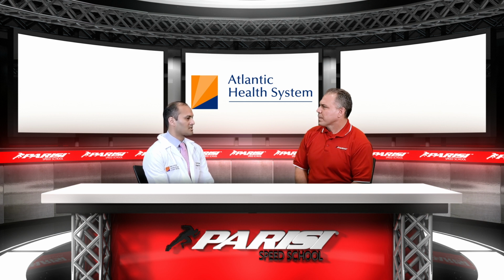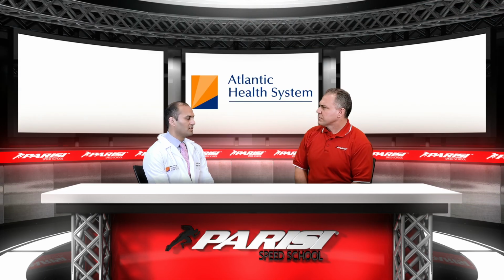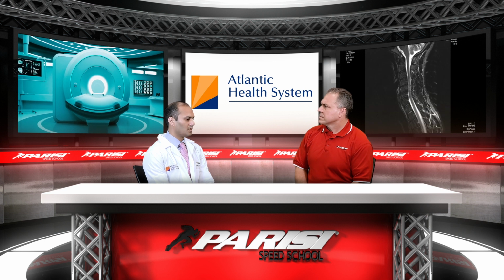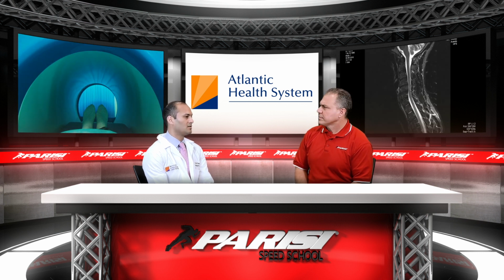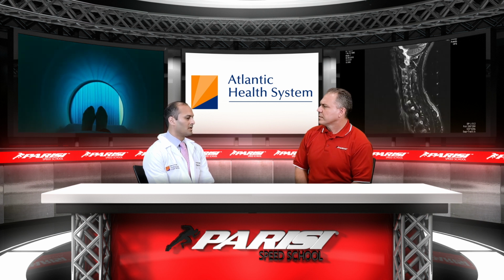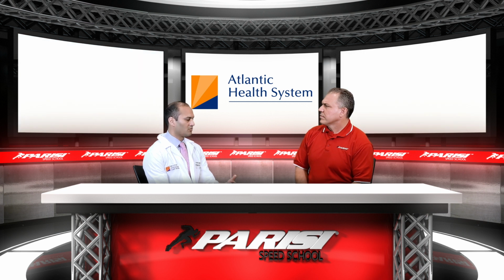Another technology that's very exciting for the musculoskeletal system is MRI. We get really detailed information there, and we can see things like menisci, labrum, really small structures that make a big difference in the performance of athletes. So if you have a labral tear and you're a throwing athlete, that can put you out for a long time. And not knowing that that's the cause of your injury can be a big problem when someone's giving you physical therapy or directing other treatments. So having the right diagnosis with an MRI is very helpful.